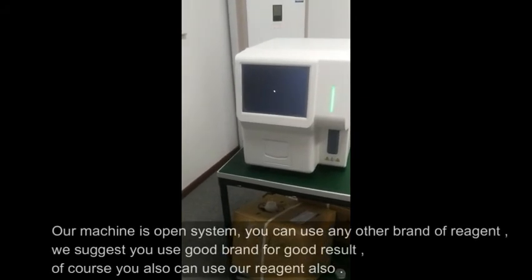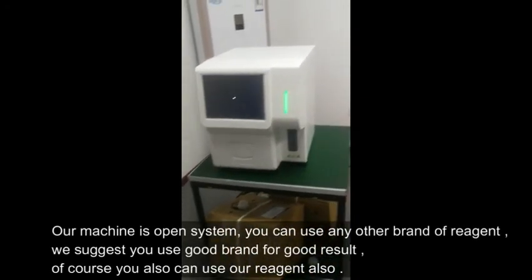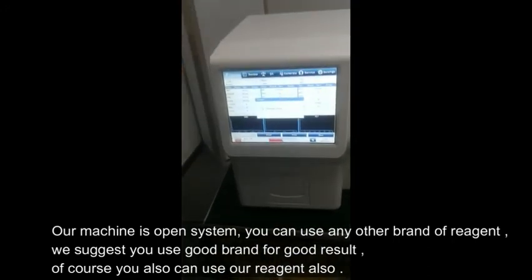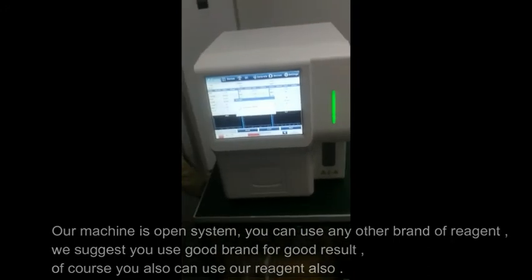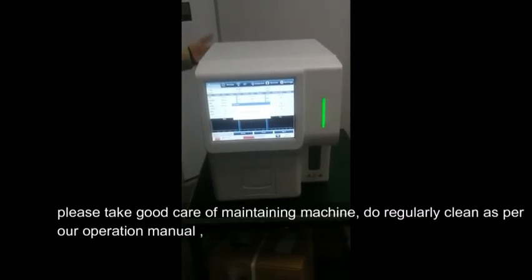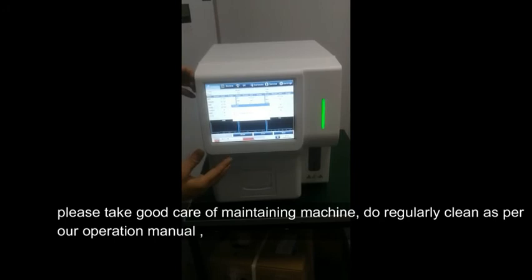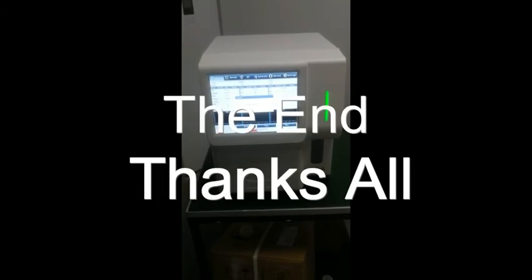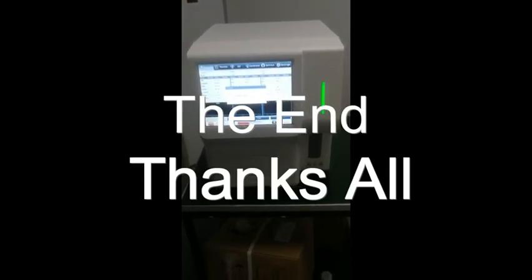Our machine is an open system — you can use any brand of reagent. We suggest you use a good brand for good results, but of course you can also use our reagent. Please take good care of maintaining the machine and do regular cleaning as per our operation manual. Thank you very much for choosing our hematology analyzer.